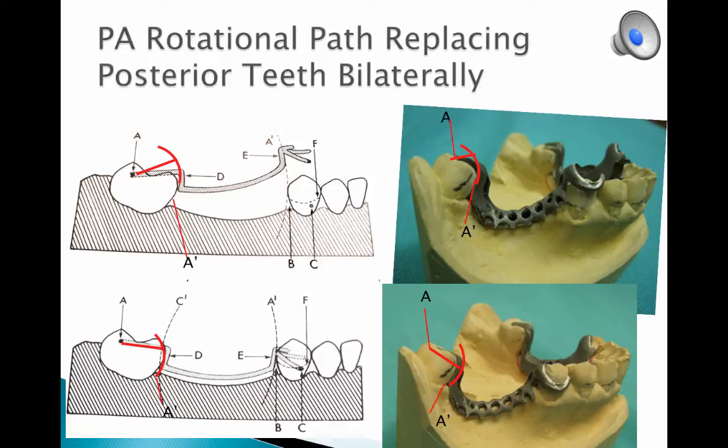The other point is placed at the cervical portion of the tooth at which the rigid retainer will be located. We're calling it A'. The cervical point of the divider is then rotated occlusally to determine that the minor connector is not into too deep of an undercut to rotate out of the area around the axis of rotation. The point of the divider should be able to move occlusally without interference. This particular framework did not rotate well when tried in the mouth. There were interferences and the retentive component was in too deep of an undercut. That retainer must be at least a 0.01 undercut position. It can be into a deeper one, but not so deep that you can't rotate out of it.